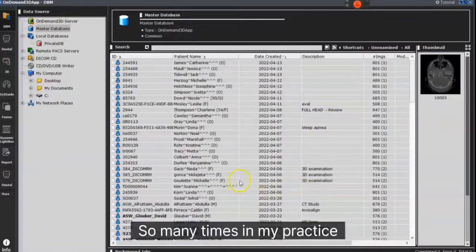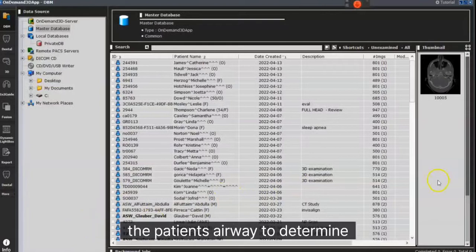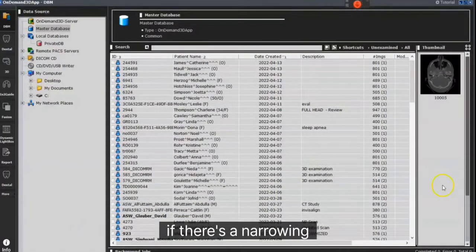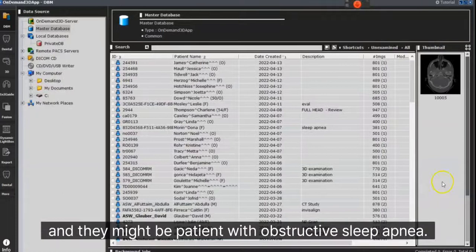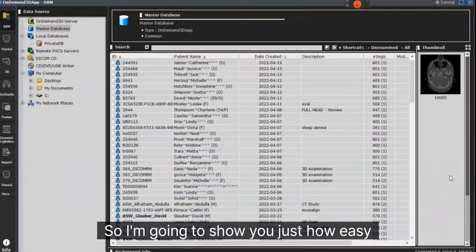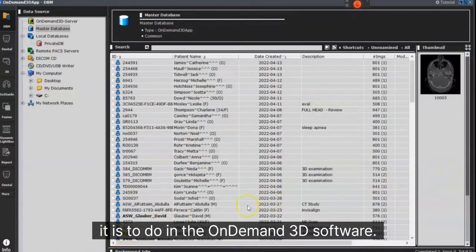Many times in my practice, I'm asked to look at the patient's airway to determine if there's a narrowing — they might be a patient with obstructive sleep apnea. I'm going to show you just how easy it is to do in the on-demand 3D software.